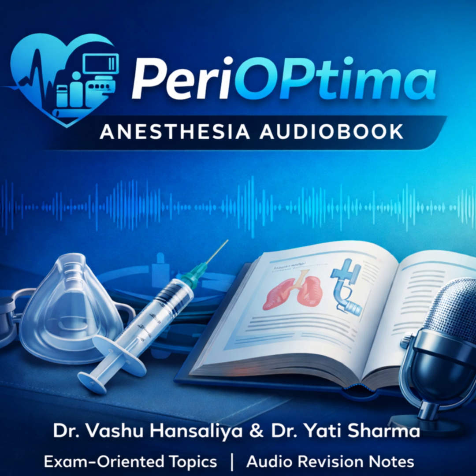That structure is perfect for the exam. Now, for the rapid-fire recap, the 10 to 12 definitive take-home points that have to be memorized before walking into the exam hall. Okay, commit these to memory. 1. SGADs are the non-invasive airway workhorses, invented by Dr. Archie Brain, bridging the mask and the ETT. 2. Classification is based on the sealing mechanism. First gen like the CLMA and second gen like the ProSeal, iGel, and Supreme.